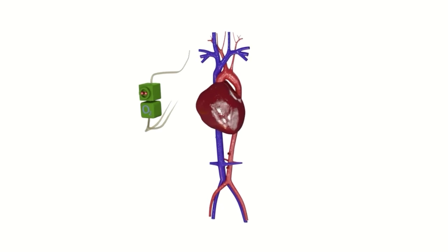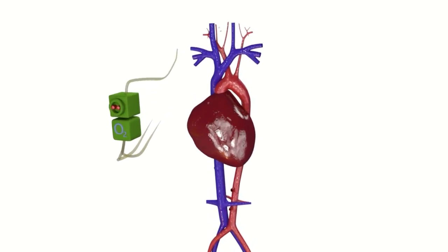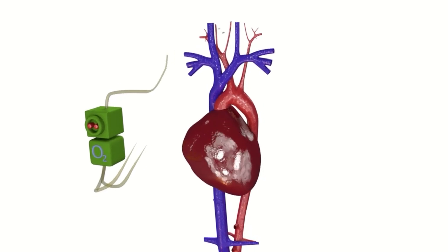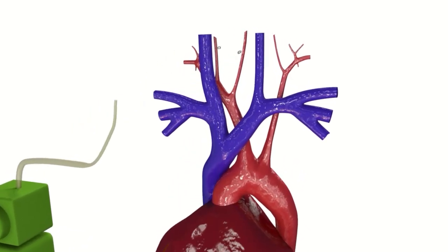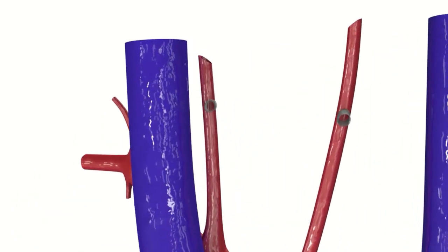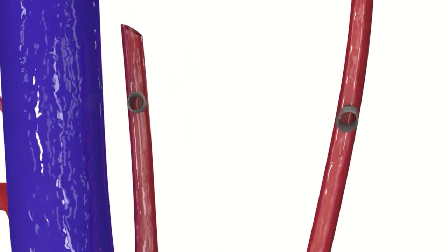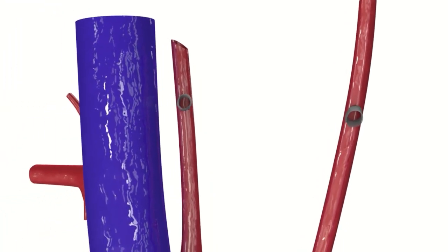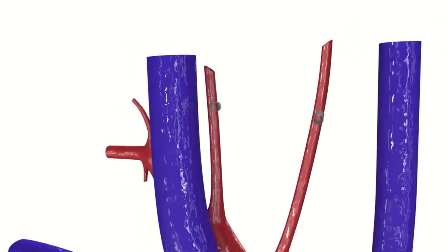Method for open and endovascular perfusion of the head and neck. This procedure is performed on patients with unresectable brain tumors and exhausted options for systemic drug therapy. It represents an implementation of high-dose localized drug therapy, enabling the concentration of therapeutic agents in the tumor region to reach levels unachievable with systemic therapy due to toxicity limitations.